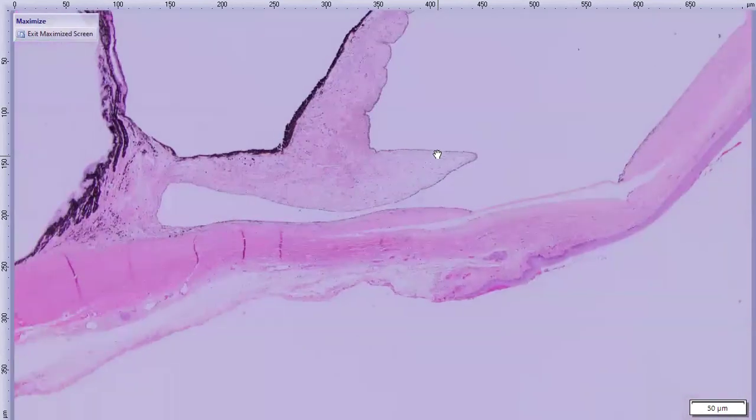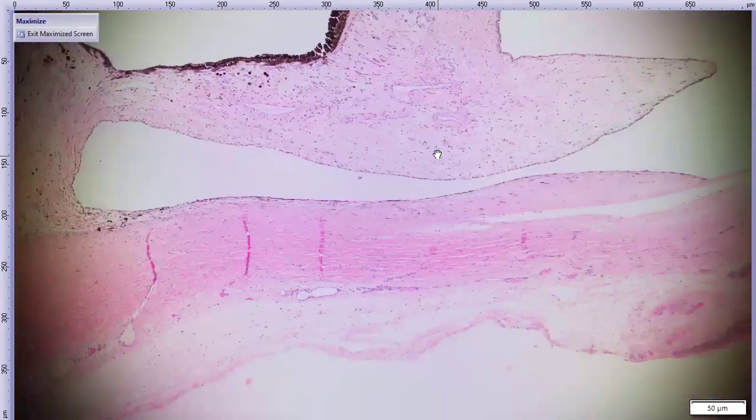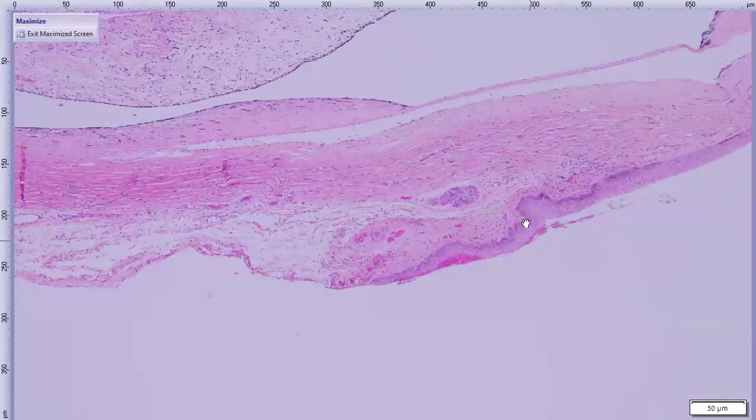Let's go back to the one that we started on, which is particularly distorted. So again, to confirm the orientation of things, we have maybe conjunctival fornix up here, and limbus starting up here. We have collagen here, which is darker pink and more intersecting streams, and this lighter pink corneal stroma here. So we basically have limbus all stretched out right here.